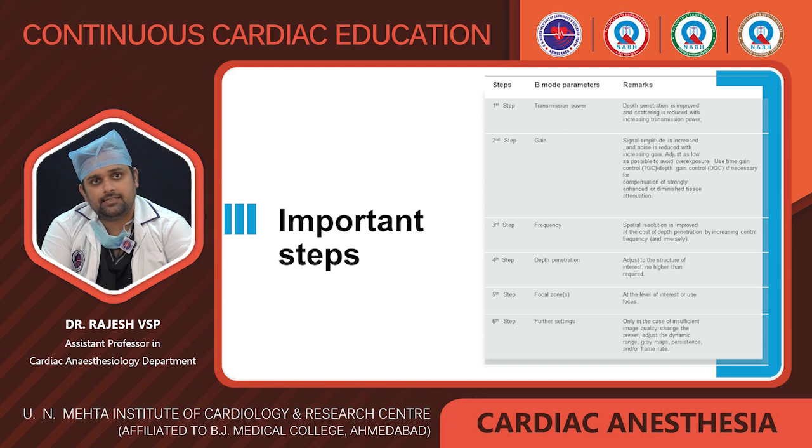Coming to the various steps in the image optimization, these 6 steps should be remembered. The first is transmission power, which is helpful in depth of penetration, and scattering is also reduced with increasing transmission power. Second is gain, which we will speak about in the later slides, and third is frequency. Fourth is depth penetration. Fifth is focal zones, and lastly other settings such as adjusting the dynamic range and different gray maps and or frame rate.